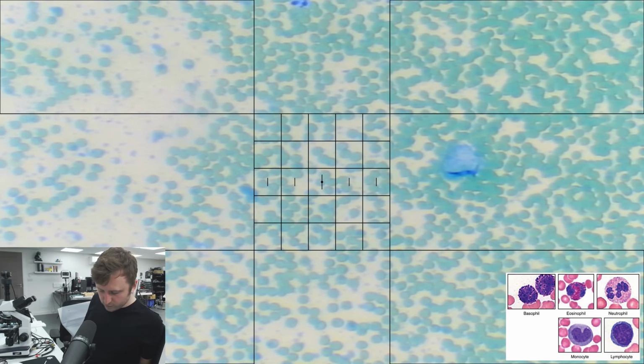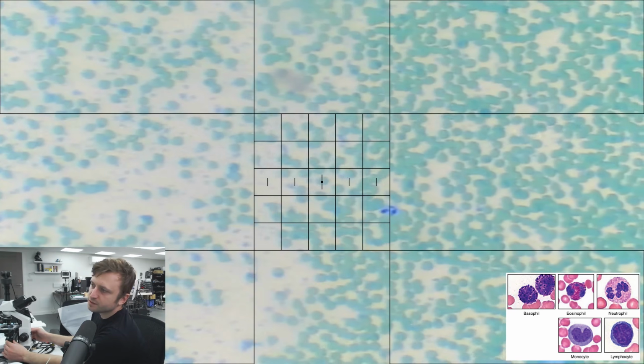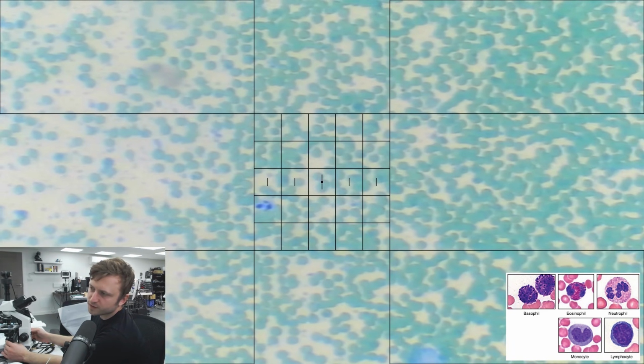Eosinophils usually 1 to 4%. Again, I'm not sure about that because I can't count them. And they didn't find any in the last blood test. And basophils 0.5 to 1. So it could also be the case that they're just not there. And band neutrophils, which are immature ones, typically 0 to 3%. And they might have come under some of the unknowns. So again, we've got 23% unknown, which could be anything. So that's interesting. And this was done from 10 times magnification plus the extra magnification from the integrated camera.